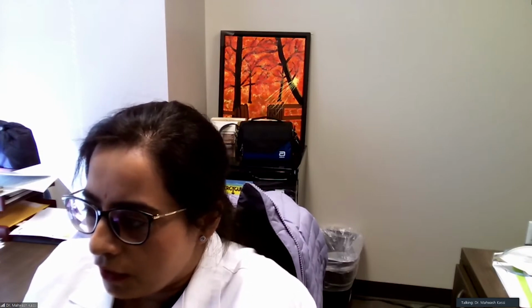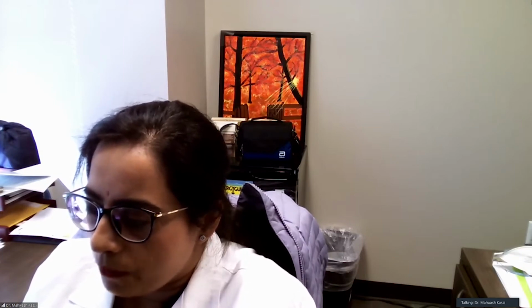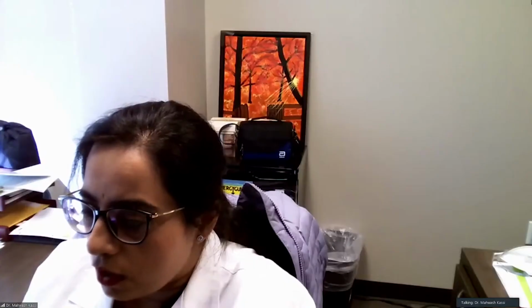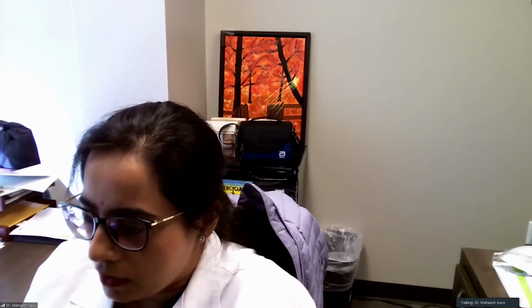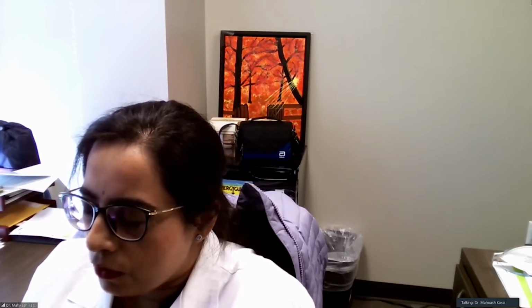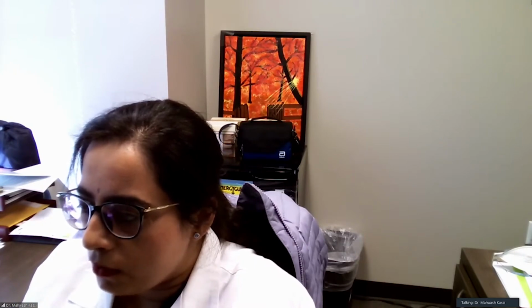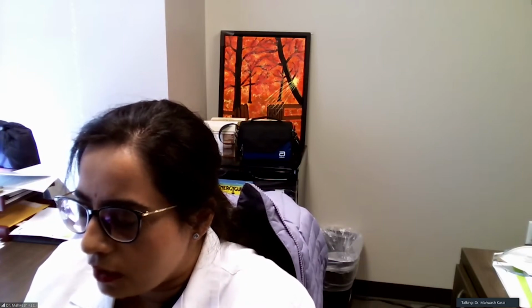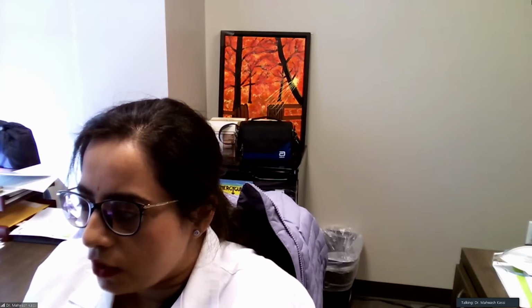We follow that very religiously because we've had a few patients where once the aortic valve opened from a closed situation, it caused a devastating complication. So that's certainly something that we do as protocol now here. I'm not saying that this is applicable to every center, but this is our way of making sure that they don't get a stroke or an embolic event. The rate of that happening is maybe not super significant. It also depends on how the outflow graft is attached to the ascending aorta, but when it happens, it has serious consequences. So that's at least how we ensure that the root thrombus doesn't cause problems for us.